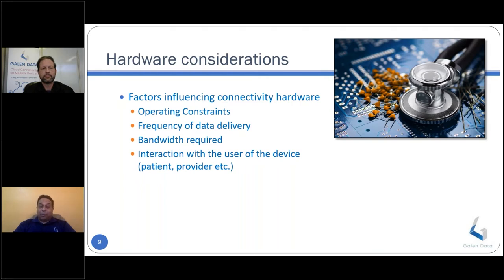Connect wireless protocols are also an important aspect, specifically if your device is going to be in a constrained environment, for example a hospital, where you may not be able to get on Wi-Fi easily, or if you do get Wi-Fi, you still have a lot of radio frequency interference. Also, if you go into a more remote field, you may not have Wi-Fi, so you may have to depend on cellular, or something similar.